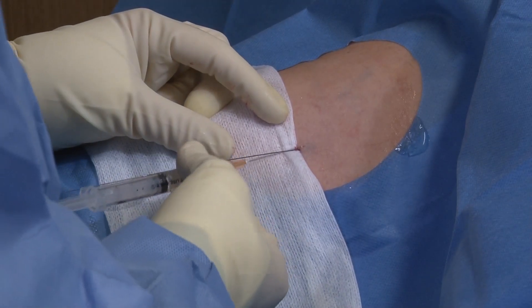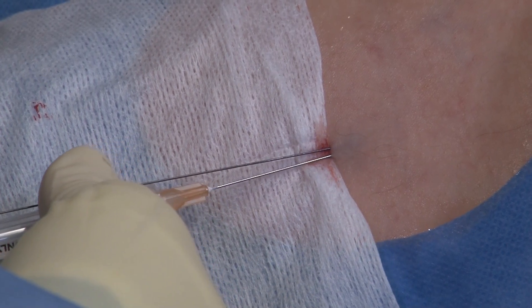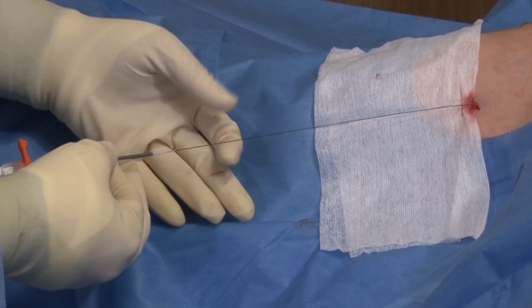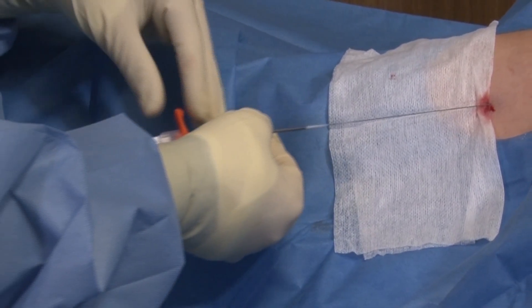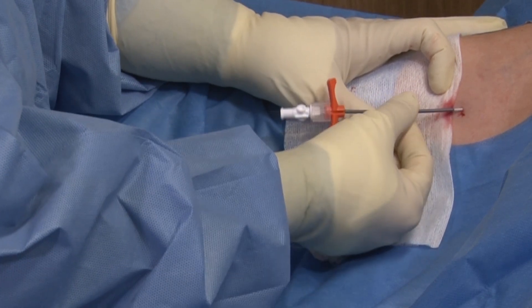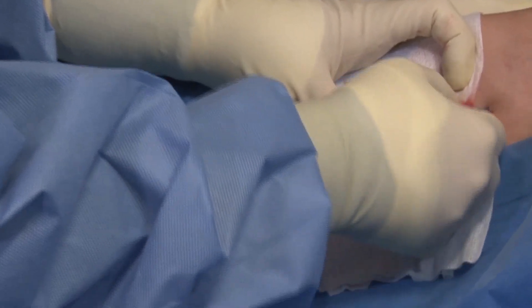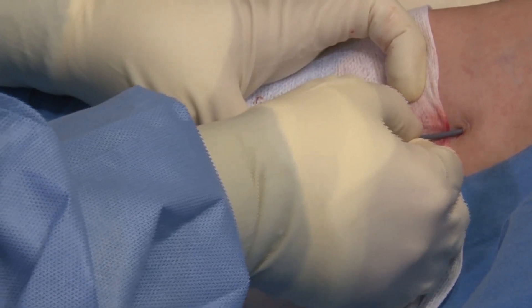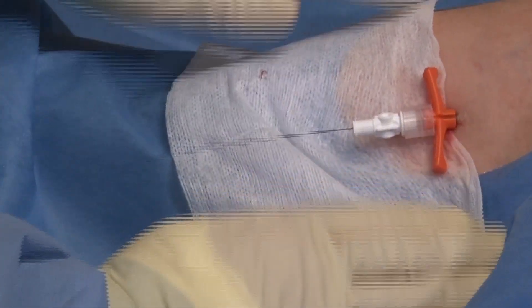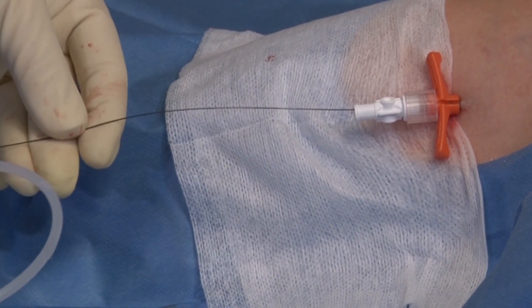Consider infiltration of further local anaesthetic if required. Place the dilator over the wire and advance through the skin, applying skin traction distally to the insertion site using your non-dominant hand. Hold the dilator close to the skin to avoid bending it — a twisting motion can be used. Advance to the hilt and check for free movement of the wire, which will indicate the wire and dilator are in alignment in the vessel.